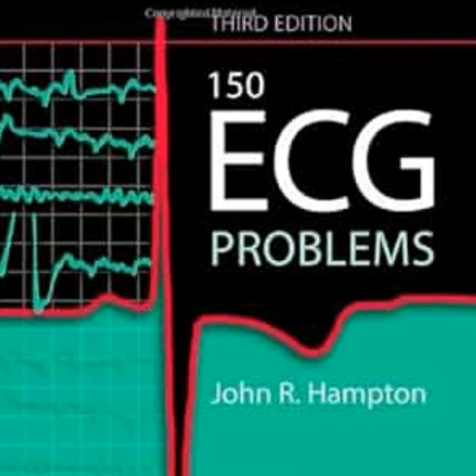So there's less insulation. Exactly. The electrical signal just doesn't have to travel through all those insulating layers to reach the leads. So naturally, the amplitude of the signal is going to be significantly higher on the printout. Wow. The machine just interprets that strong signal as a large muscle mass, fulfilling the criteria for LVH. But in reality, the leads are literally just sitting closer to the source.